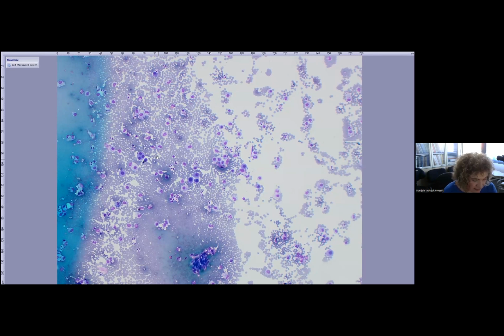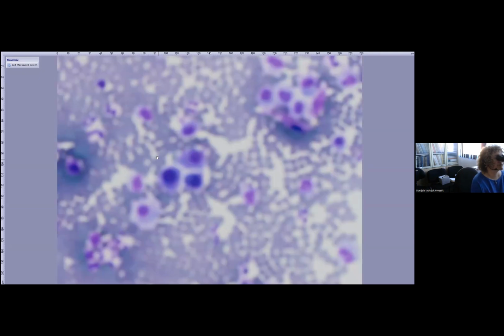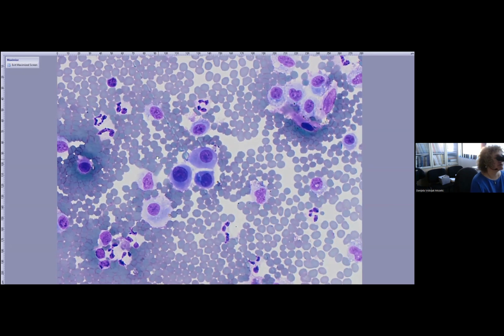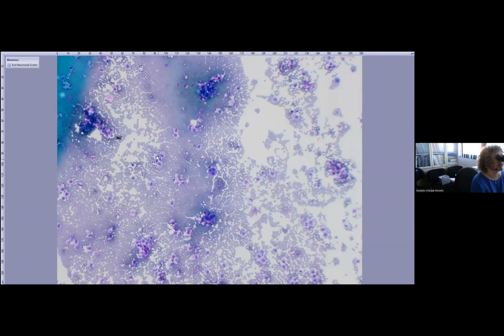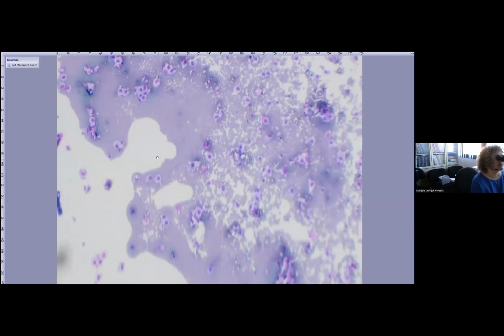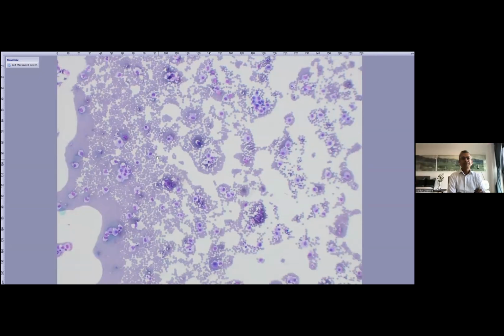So the next example was an intraoperative lavage, and the final diagnosis was high-grade serous carcinoma, a histological diagnosis, and this was a peritoneal fluid with, I think you all agree, mesothelial cells, but we have to really be sure that these are not malignant cells.